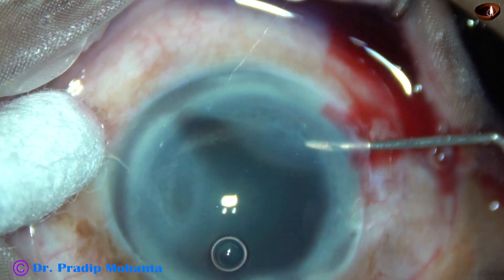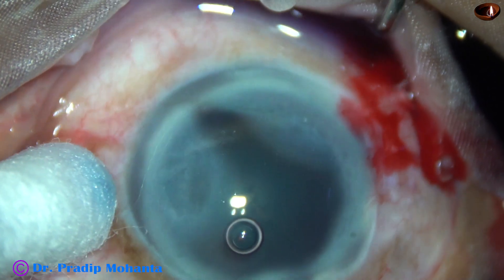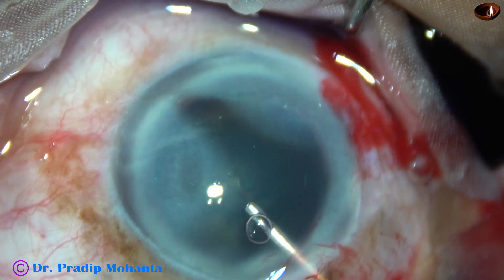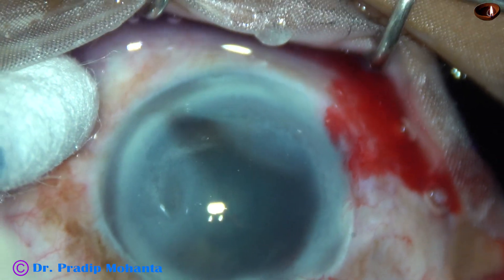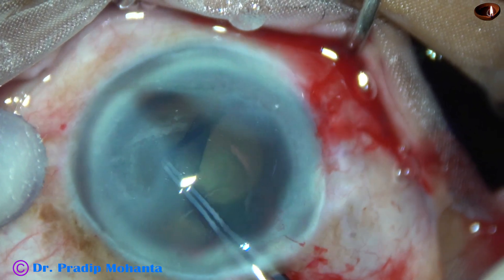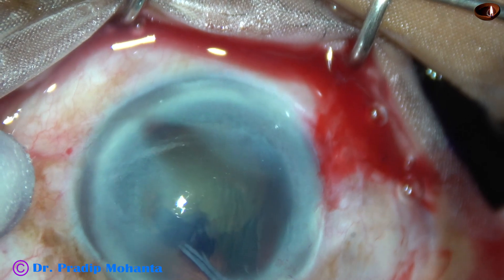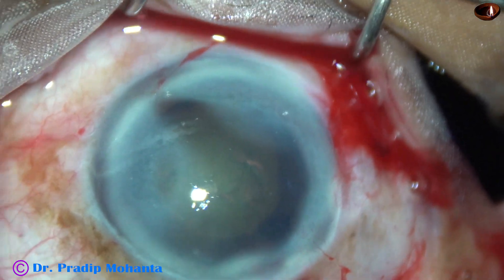Now I am going to do capsulorhexis. The anterior capsule is incised with a 26-gauge needle. Now this air bubble may cause some disturbance during rhexis, so I inject some visco and remove this air bubble. Now I can see the capsule quite clearly and I have done an adequate size rhexis of about 5.5 mm.